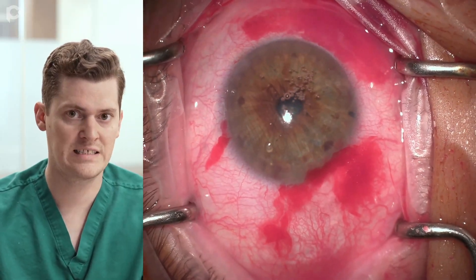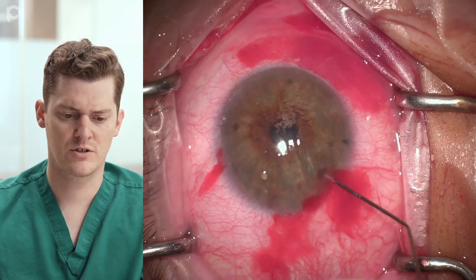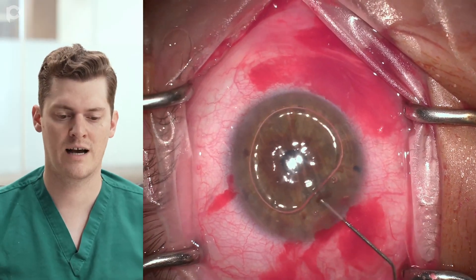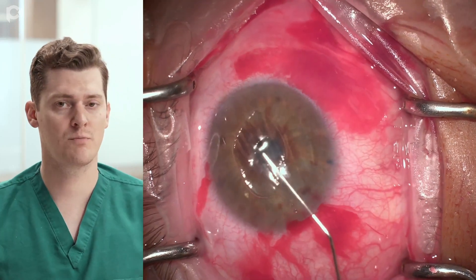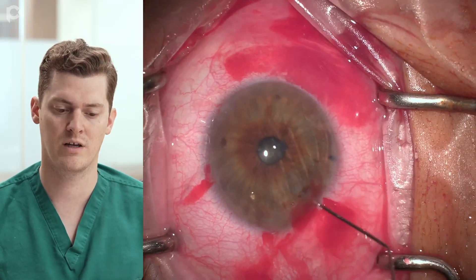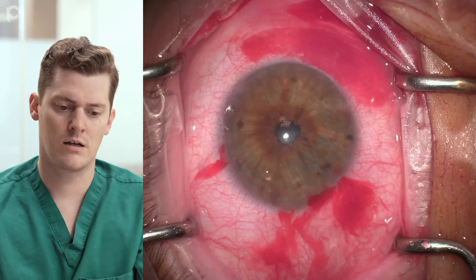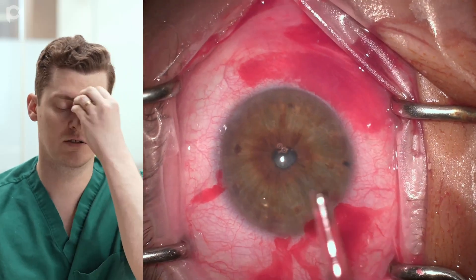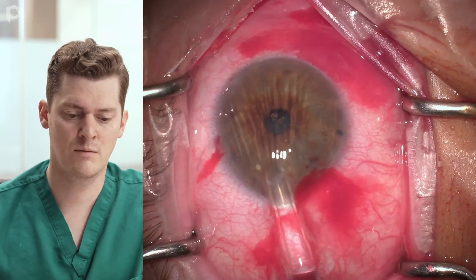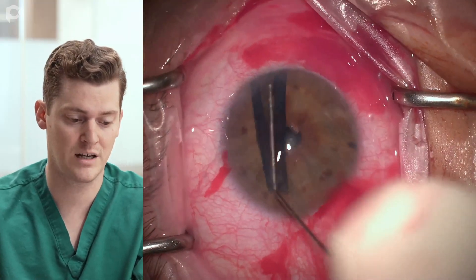Removing the AC maintainer and going in to remove excess air bubbles before graft unfolding. There are a lot of bubbles here, and you see I accidentally shoot more air bubbles into the eye — this highlights the point that after aspirating air, before you go back in to inject BSS, make sure that air is fully out of your BSS cannula or you'll be injecting air again. Make sure the chamber is deepenable at this point; if wounds aren't sealing, hydrate them because the chamber needs to stay formed during graft unfolding.